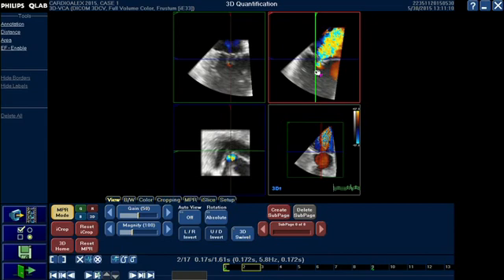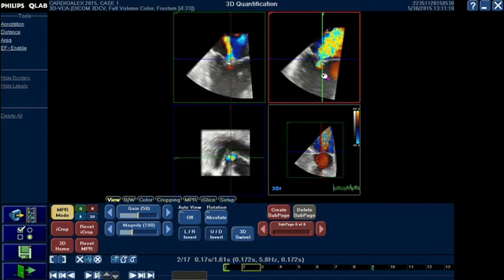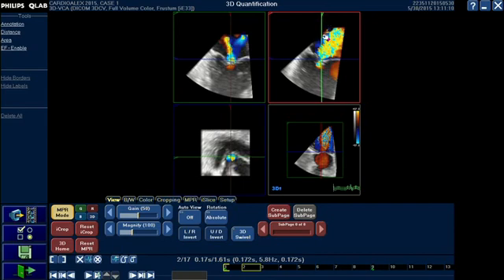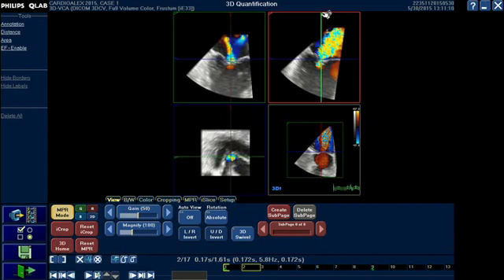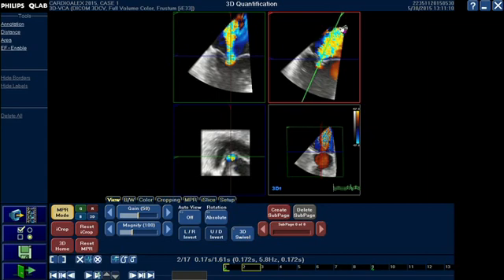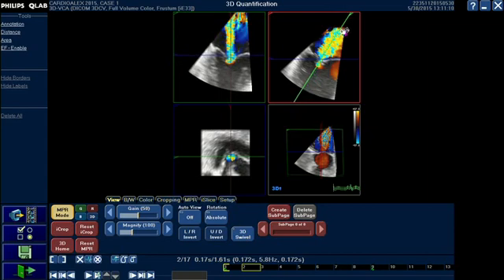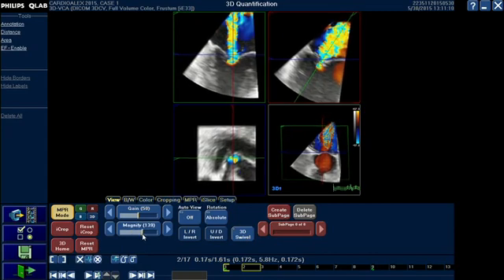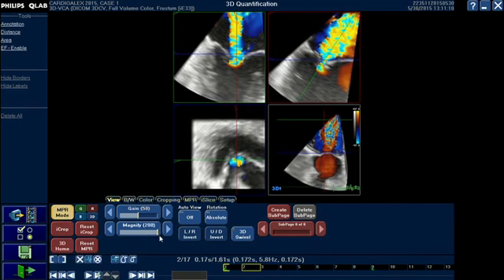I'm choosing the frame that shows the maximum regurgitation jet, then moving my lines to cut directly on the jet so I can see it in multiple views. I then rotate this line — if you grab the line from the middle it becomes a hand, meaning you can move it side to side; if you grab it from the periphery it shows a hand with a curved arrow, meaning you can rotate the line. I'm rotating the line to see the maximum extent of the jet in both views, and I can also magnify to reduce the error margin.